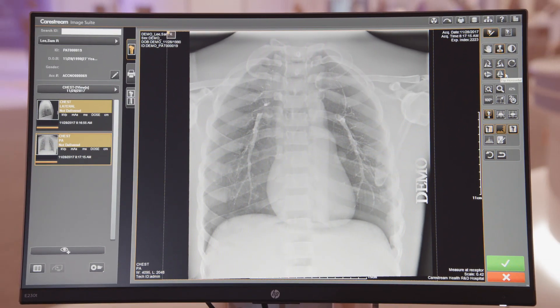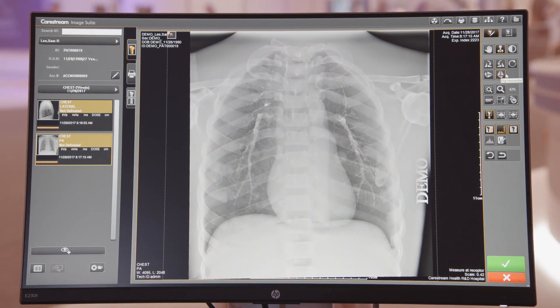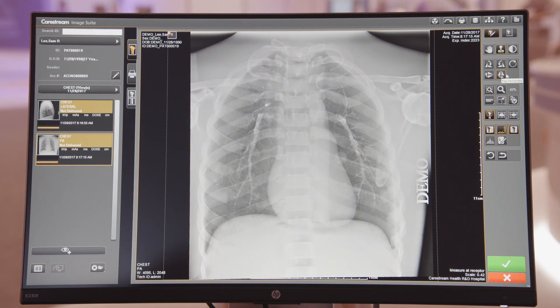Using our DRX Core Detector in beam sensing mode, you simply acquire your images the same way you would with film. Once the detector acquires the image, it will automatically transfer it to the ImageSuite software for your review and editing.